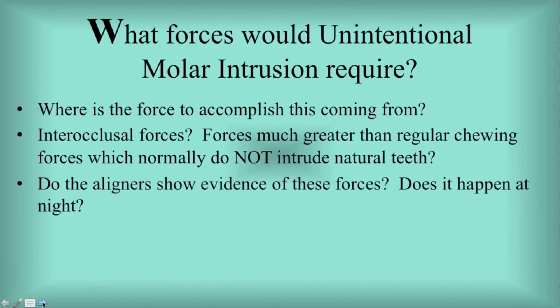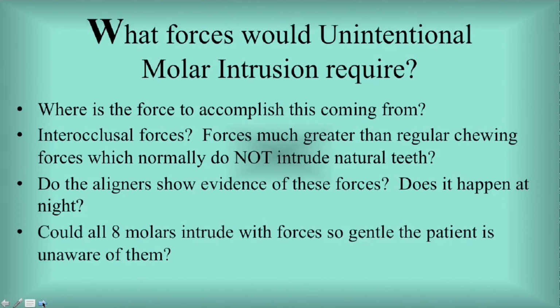Do the aligners show evidence of this kind of force, either by distension or malformation or wear spots on the aligners? Does it happen at night? Is the patient aware of this during the day? If it only happens at night, could all 8 molars and all 8 bicuspids intrude with forces that are so gentle, yet so forceful the patient's unaware of them? Forceful enough to intrude teeth greater than chewing forces, but so gentle the patient doesn't even know they're intruding.